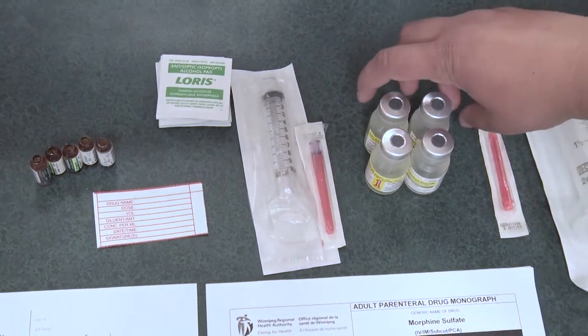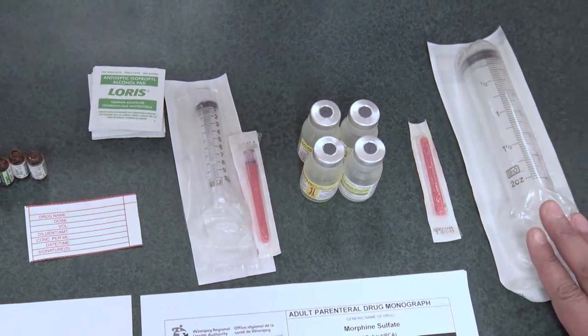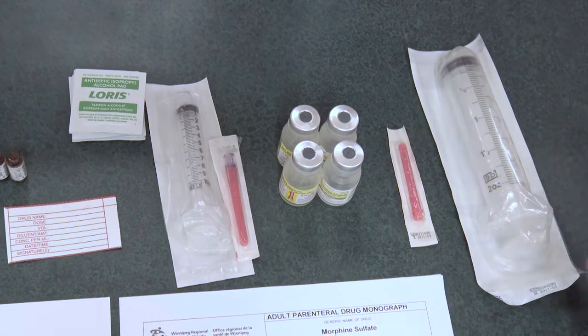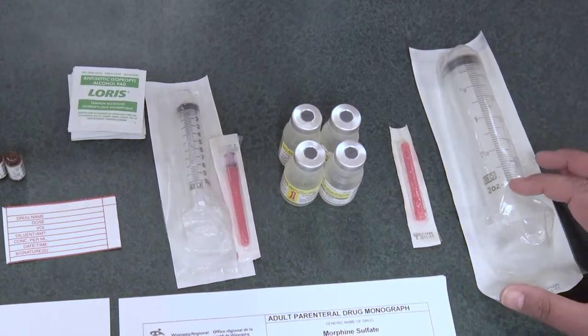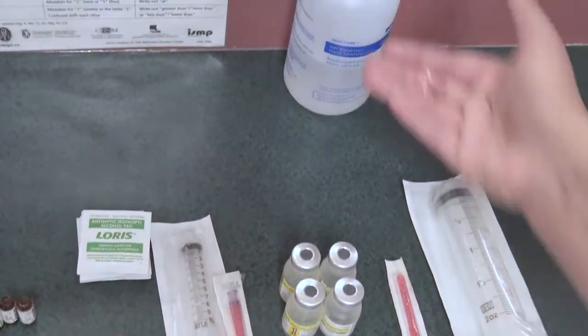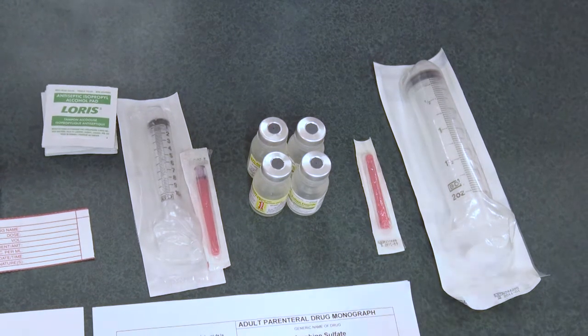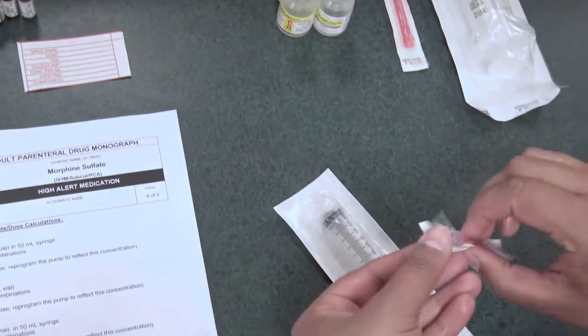I have my normal saline to dilute, another needle, and a 60 mL syringe, because this is a total of 50 milliliters, but syringes don't come in 50, so I'm just going to have a 10 milliliter gap. And then of course alcohol to clean your hands. So let's get started. I'm going to clean my hands first, and I'm going to use my filter needle to draw up my medication.